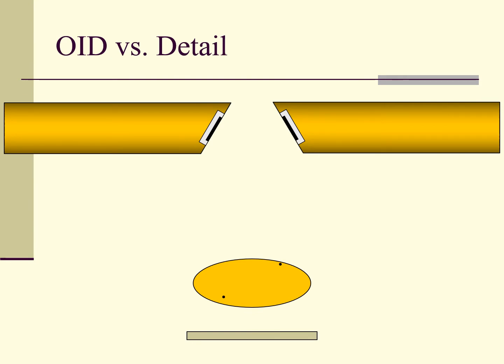In this example, we have two identical anodes, a patient in need of examination, and below that, an image receptor. The small differences are in the patient. On the left of the patient is a point or an object near the image receptor, and on the right, a point much further from the image receptor.